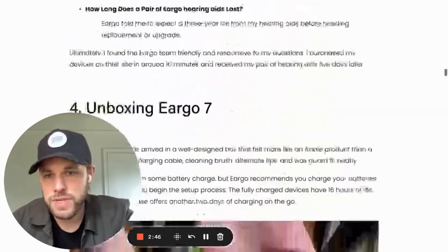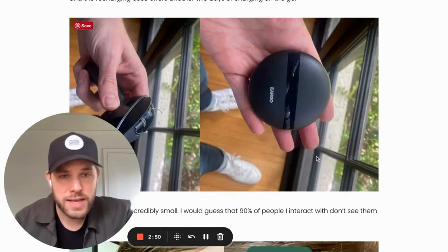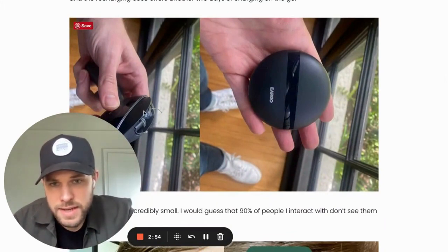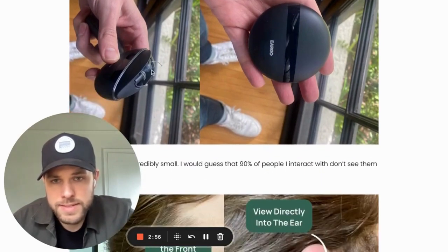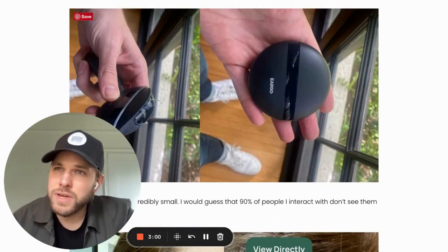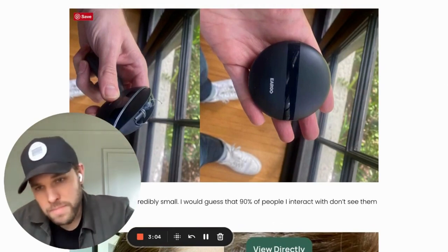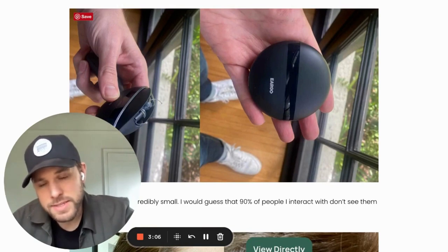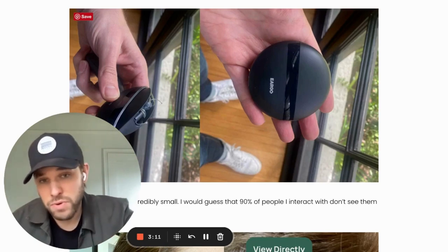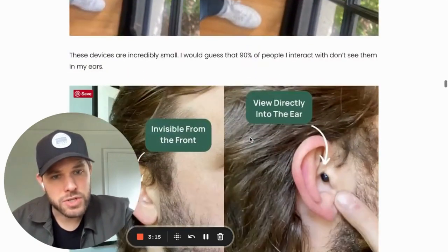Let's get into the unboxing experience. This is what the product looks like — it's the recharge case, and inside you can see where the product sits. Every time you charge the device, you get 16 hours of wear, and then you can put them back in the charging case two times without plugging it back in and get another full charge. So it's a pretty robust charging option and a good-looking charger.